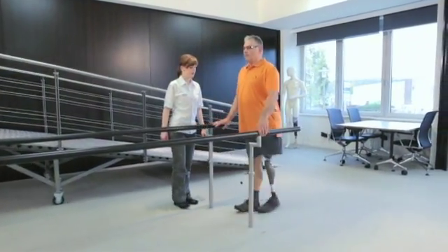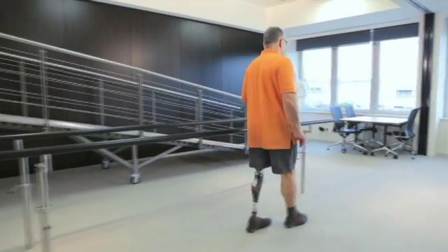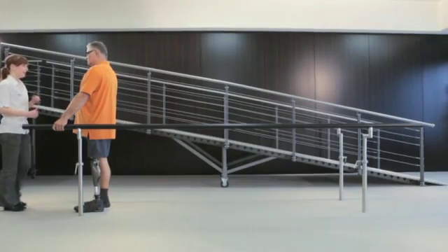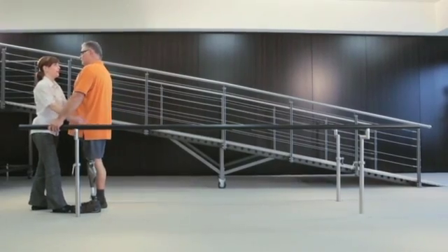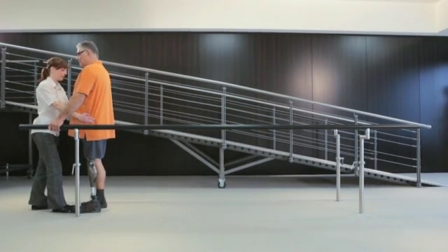For training, have the user move backwards. Motivate the user to always load the prosthesis, rolling from the toe to the heel. Start this training in the parallel bars to make it as secure as possible for the user. In a later stage, you can help the knee to bend by briefly placing your foot on the prosthetic foot.